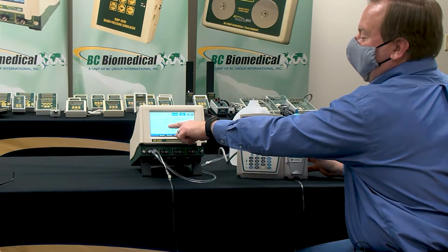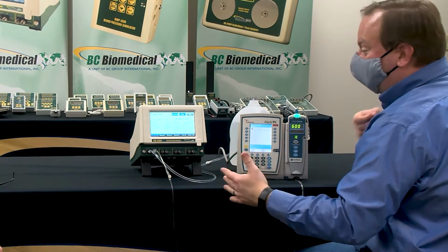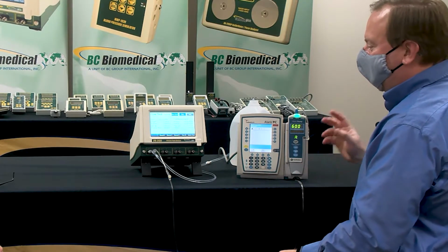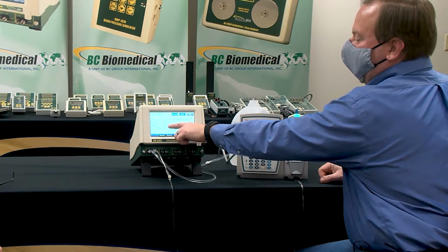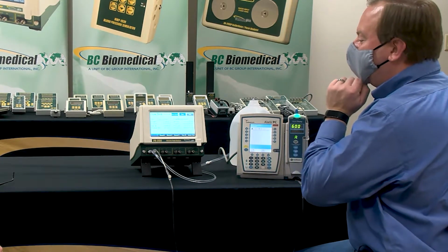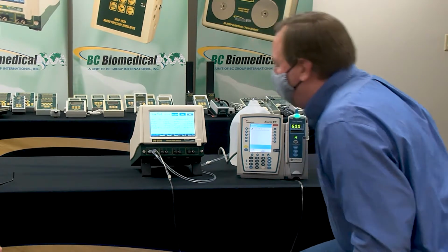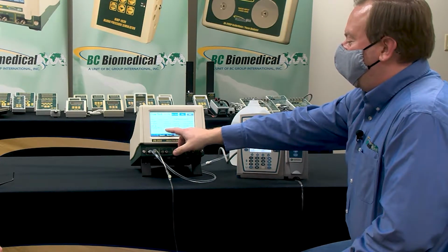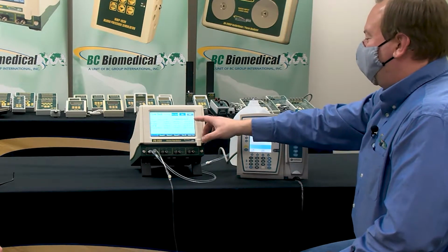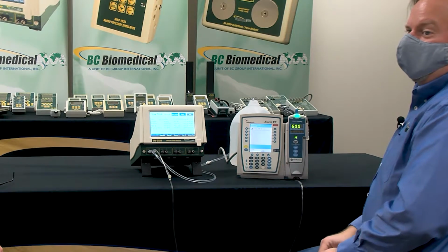Okay, so my pressure's pretty high now, right? Because it's pushing pretty hard. More volume. It's got more flow. And so now I sped up, it's speeding up, it's trying to keep that pressure down at 0.2. And you'll see here, now we got 400% error because our average flow rate is 500, closer to 600 when I told it was gonna be 100.